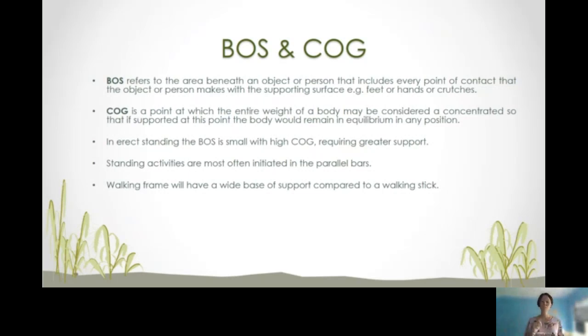So, to conclude on base of support and center of gravity, in a standing position upright, the base of support is small with high center of gravity on one point, requiring greater support. Standing activities are most often initiated for that reason in parallel bars.